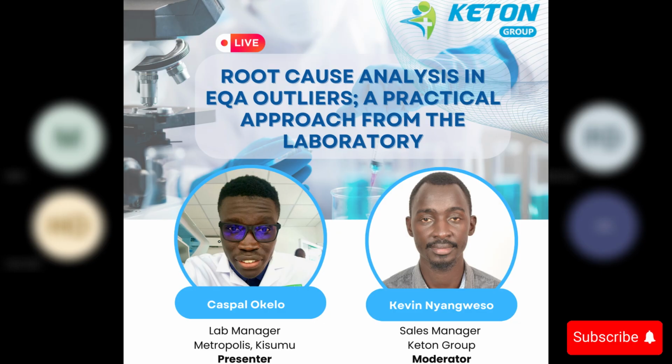Thank you very much, Fred, for your comment. That's very much welcome. As I had mentioned, the use of floating and fixed mean is always a lab quality policy definition issue. I mentioned the statistical significance of your cumulative mean. Statistical significance starts at 20 runs, but let's say you've had 140 runs.